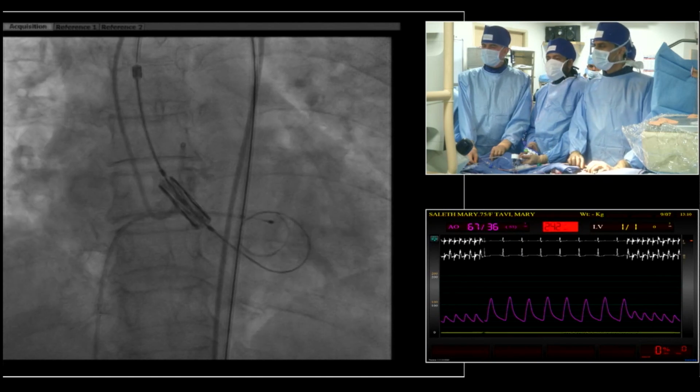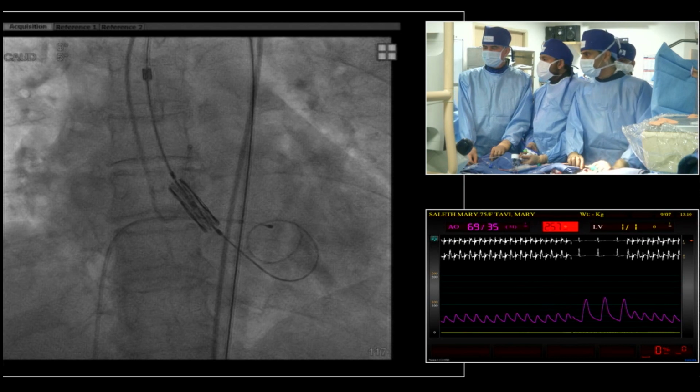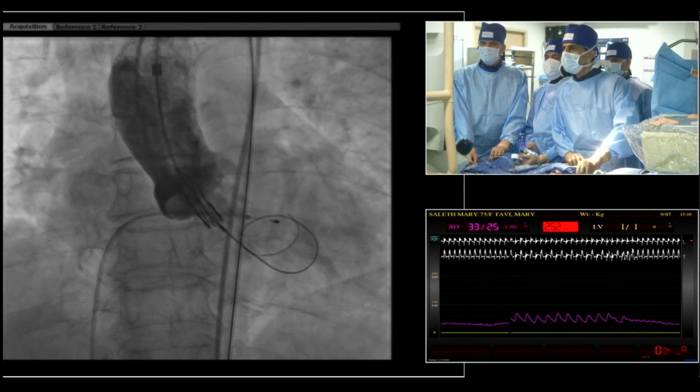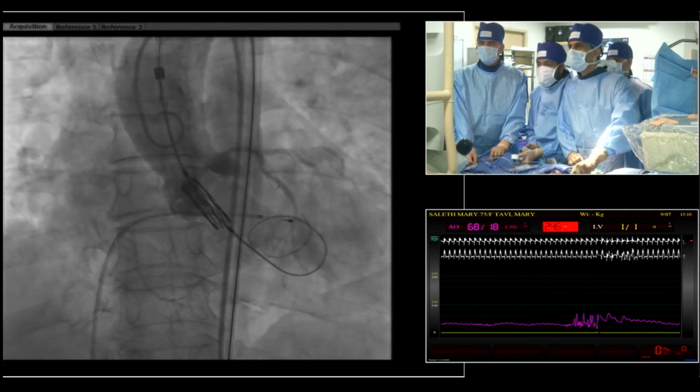Okay. Pacing on. Pacing is on. No, I don't have the pressures down yet. So we need a better drop of the pressure. Yeah, it's better now. Yeah, inject. What do you feel? That's good enough. Okay, good. Go up. Go. Go up.